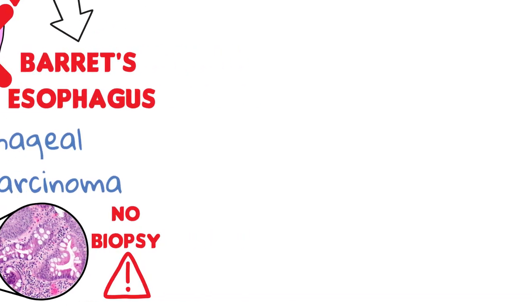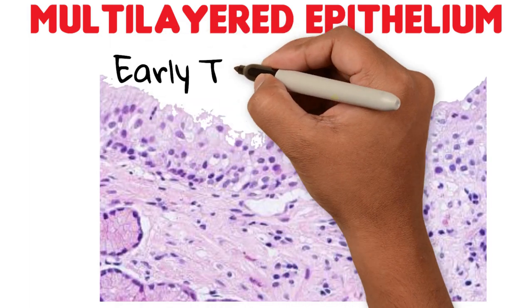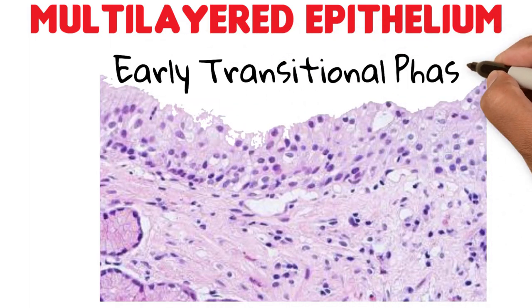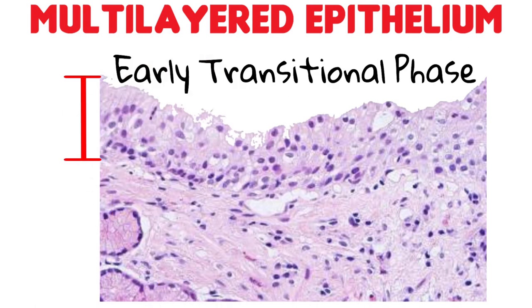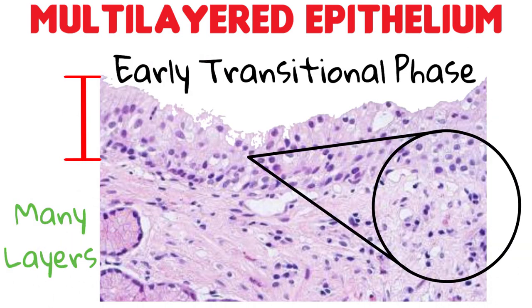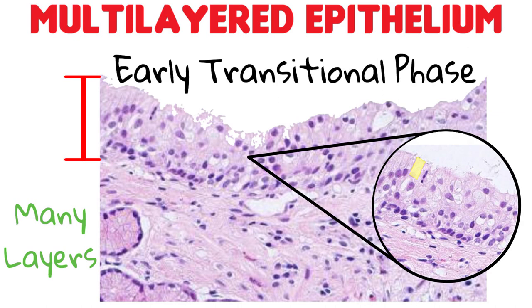Finally, another type of epithelium known as multilayer epithelium has been described as a possible early transitional phase to columnar metaplasia. As we can see here, it is characterized by multiple layers of cells with squamous appearance but with columnar cells on top.